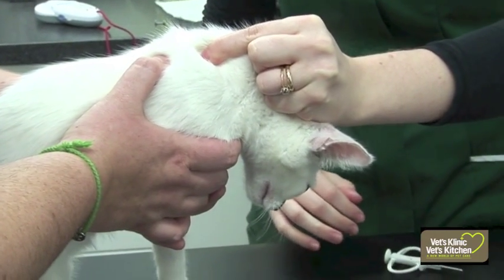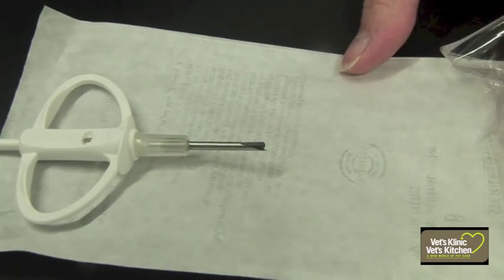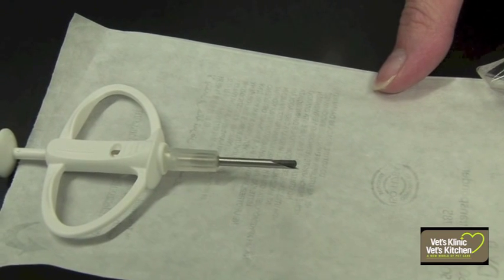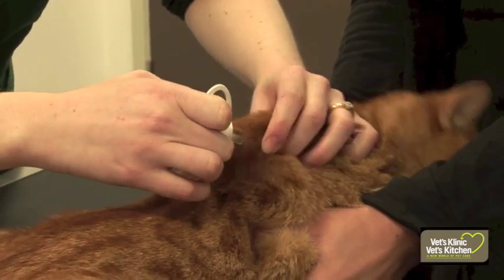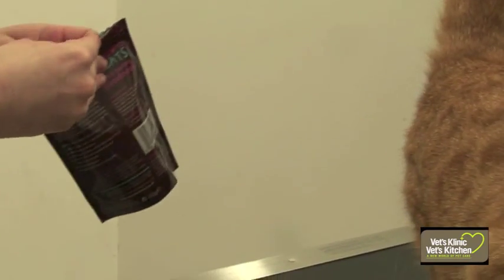It takes a matter of seconds to place, and then it can stay in for the whole of the animal's life. The actual process of placing the microchip involves using a needle, which has the microchip on the inside, and in order for the microchip to pass through the needle, the needle itself does have to be quite wide, so unfortunately it can be a little bit uncomfortable. We tend to distract the patient with treats while we place it, which works quite well.